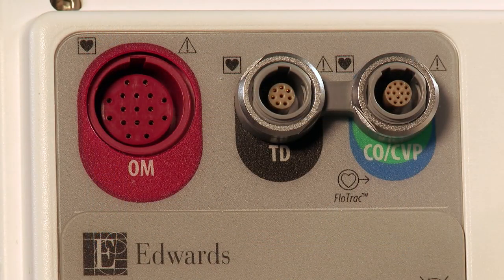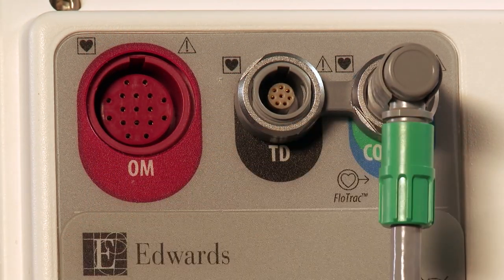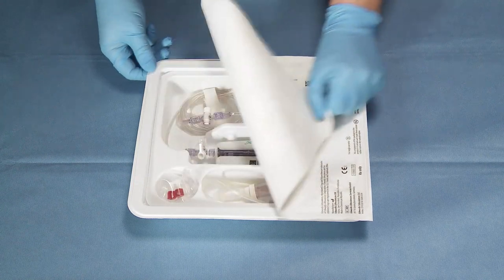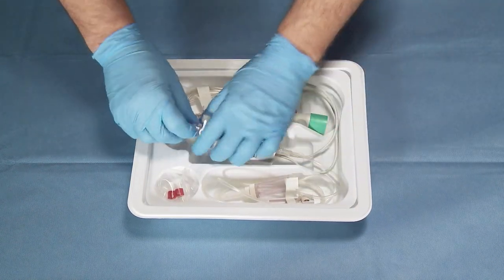Insert the trifurcated pressure cable into the green and blue color-coded CO-CVP pressure connection on the back of the data box. Open the FlowTrack Sensor Kit using aseptic techniques and check that all connections are secure.